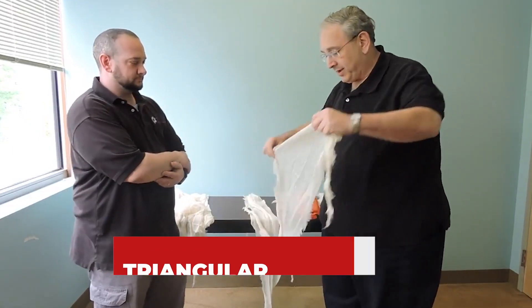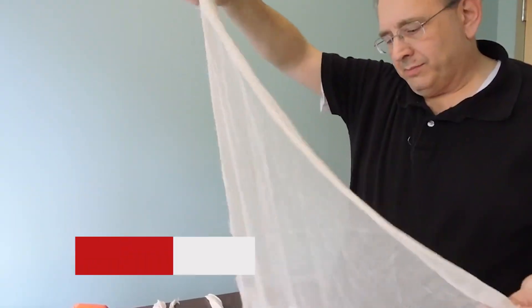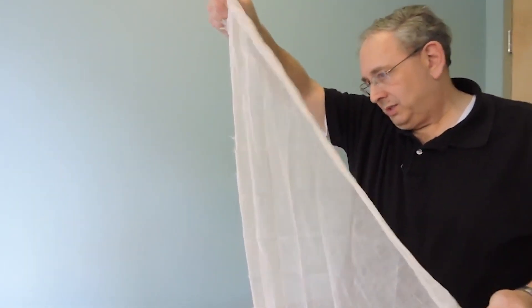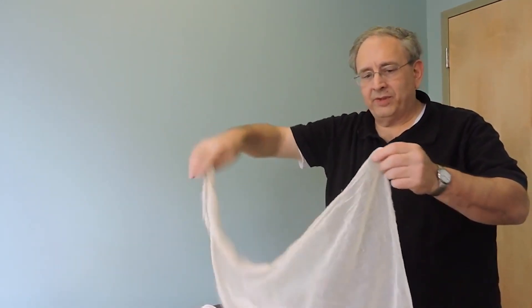You need what's called a triangular bandage. You want to start by taking the opposite end to the long side — the corner opposite the long side.